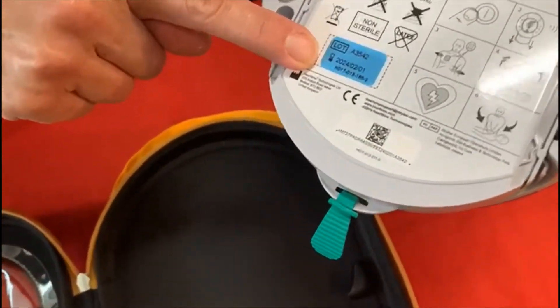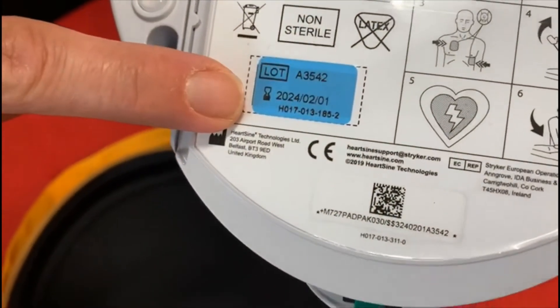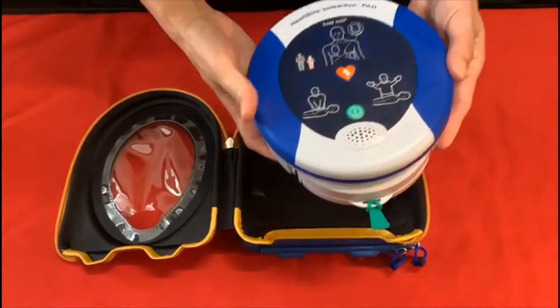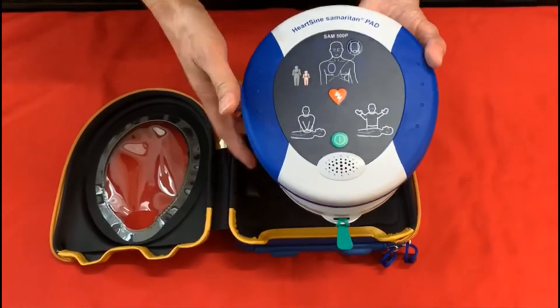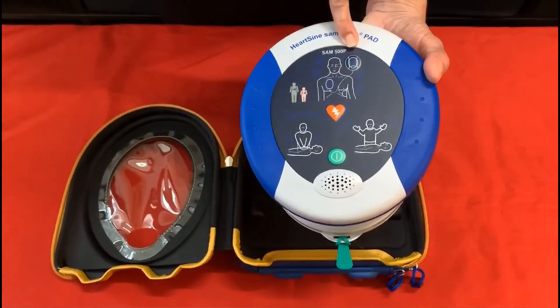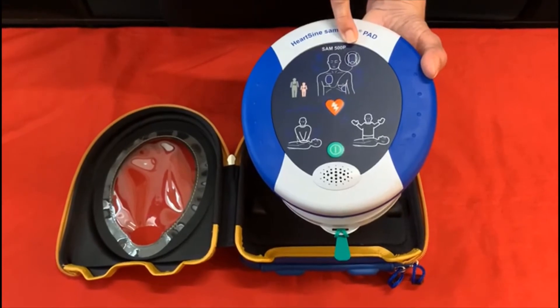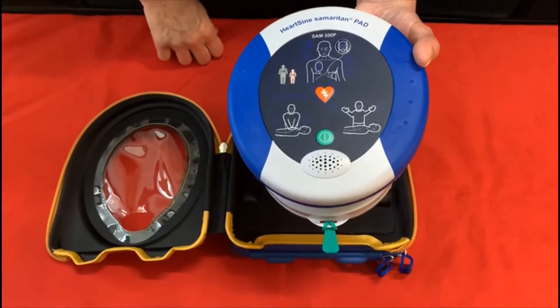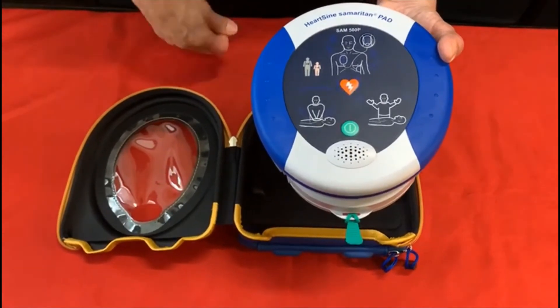You'll notice that there is an expiry date on the back there. And you'll also notice now on the front of the unit there is a green flashing light which indicates that everything is good with the unit. It's in working order, ready to use if you need to.